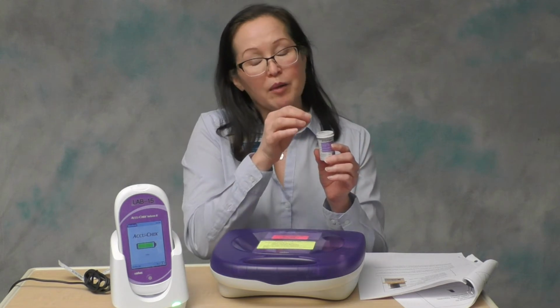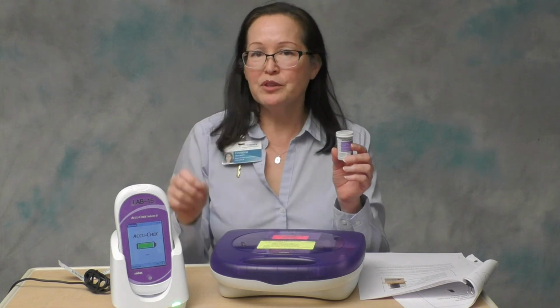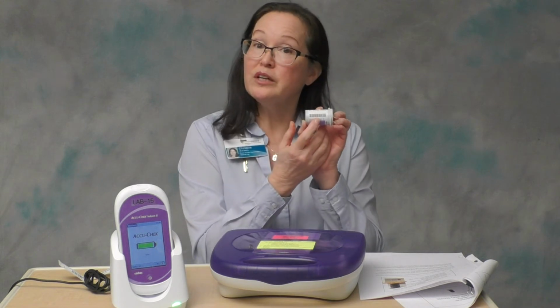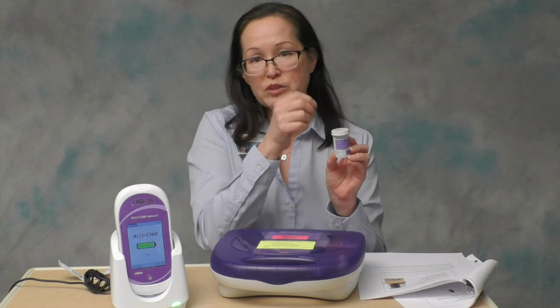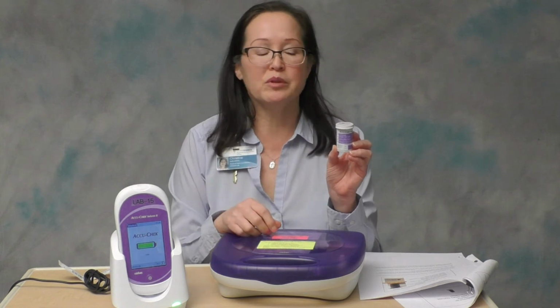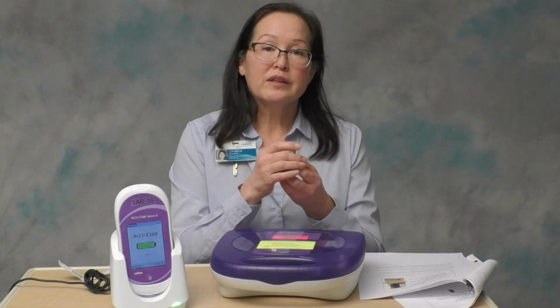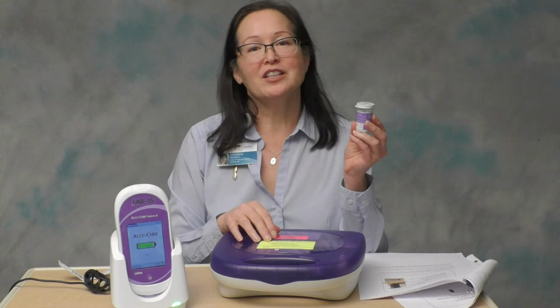The strips need to be stored in their original container until they are all used up. You never want to take a couple of strips from one container if you're just down to the last two and put them in a new container. They are all coded specifically to the lot number for that vial, so make sure you don't take them from one vial and transfer them to another. They need to be stored in their original vial with the lid snapped on tight, and it has a loud snap so that you know it's on tight.